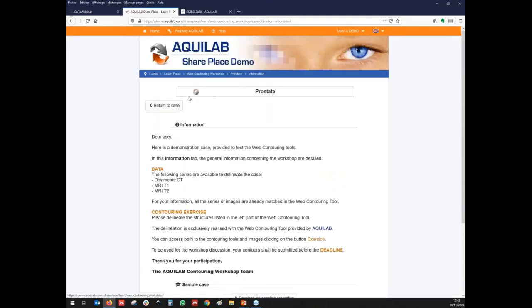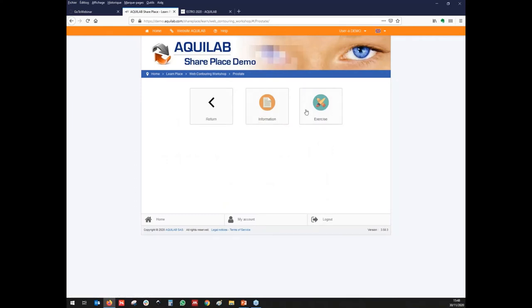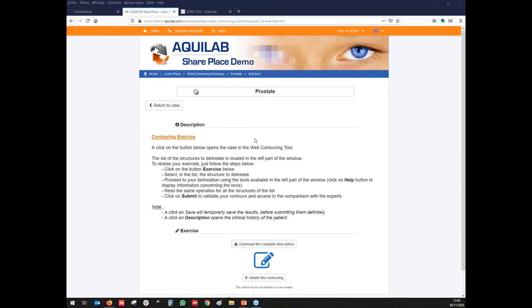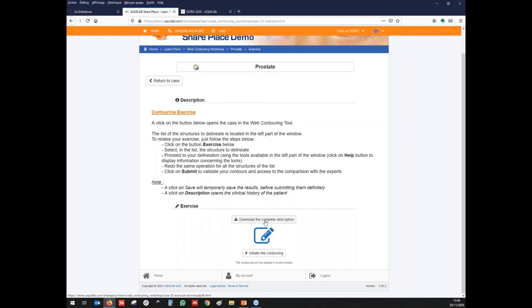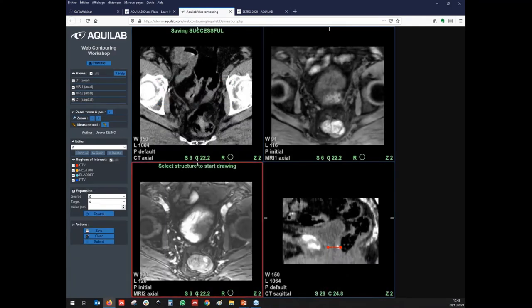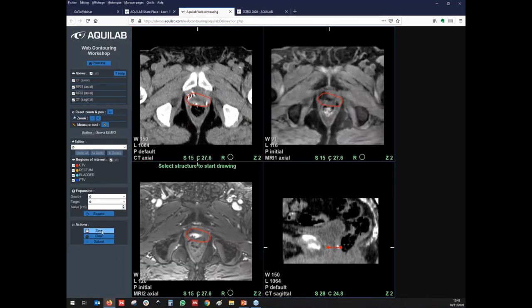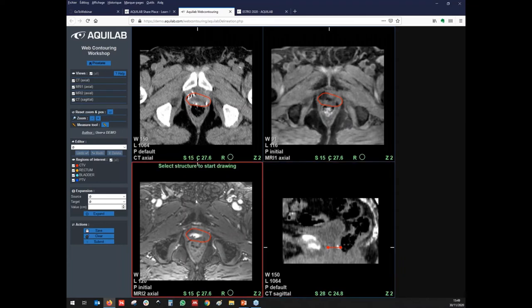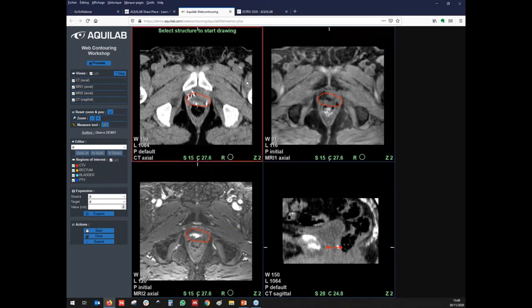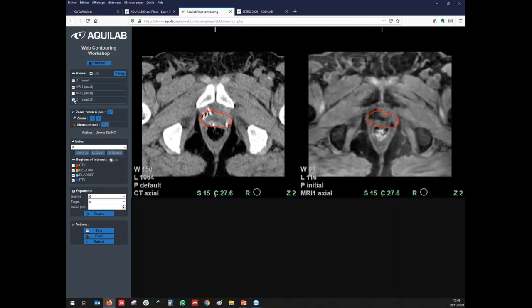Now I can go to the online contouring. I go to my exercise, where I can download a complete description of the clinical case and initiate my contouring. I have my case, and I have already done one contour which has been saved in my session. You can save a session, clear if you want, and submit your contour. Once you submit, it's not possible to modify anymore. In this prostate case, I have to contour the CTV, the rectum, the bladder, and make the PTV. I will keep two images and contour my CTV.